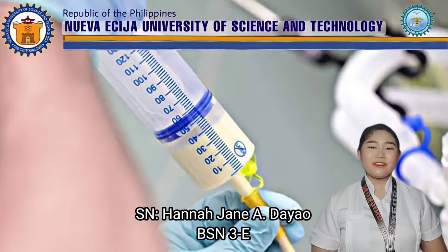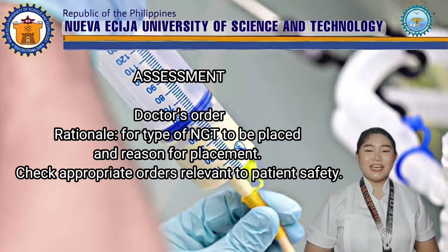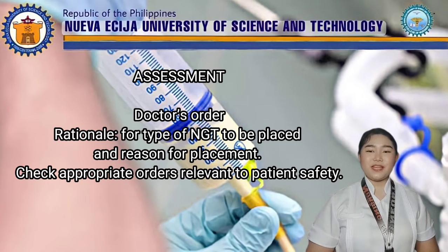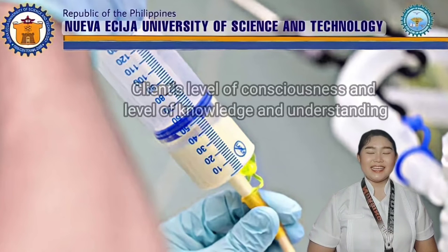Today, I am going to demonstrate to you the NGT insertion. Assessment: doctor's order. Rationale: for the type of NGT to be placed and the reason for placement, check the appropriate doctor's order relevant to patient safety. Client's level of consciousness and level of knowledge and understanding.